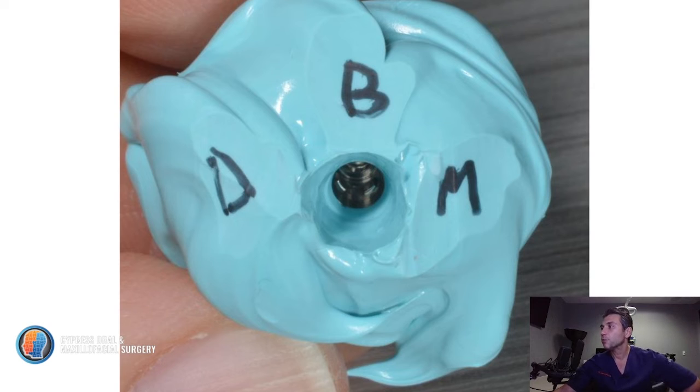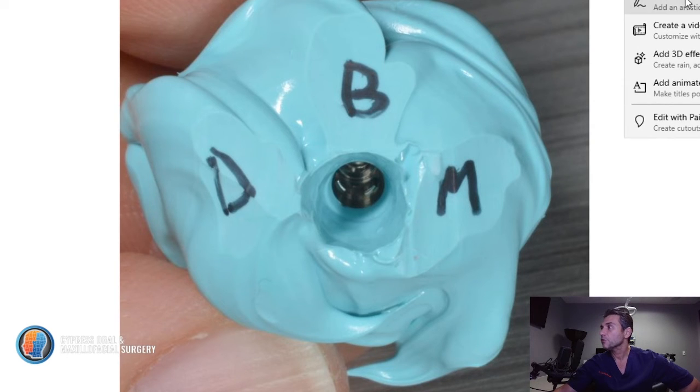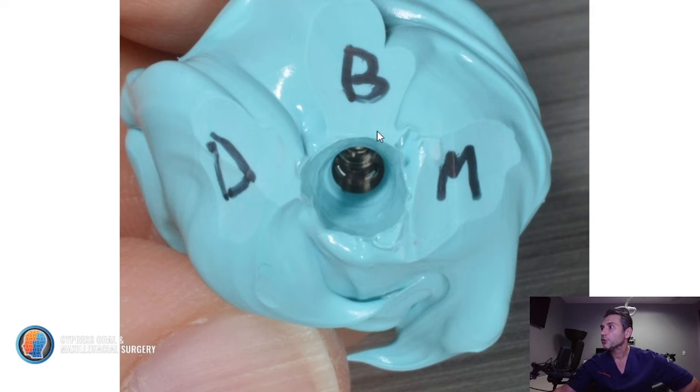You take the impression, you take the temporary off the analog, and this is why you don't want it to be too tight, because if you screw it in there tight and then you try to unscrew it, sometimes the analog will spin, and now you're just going to relay wrong information to the laboratory.